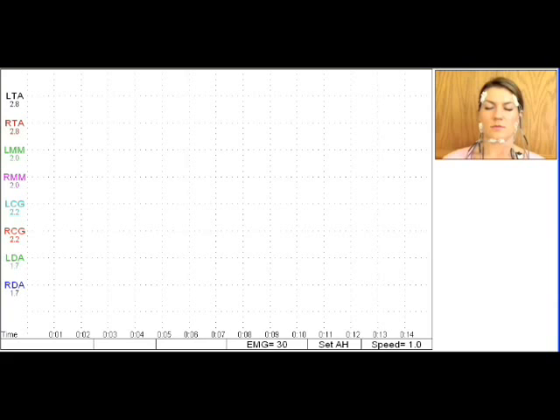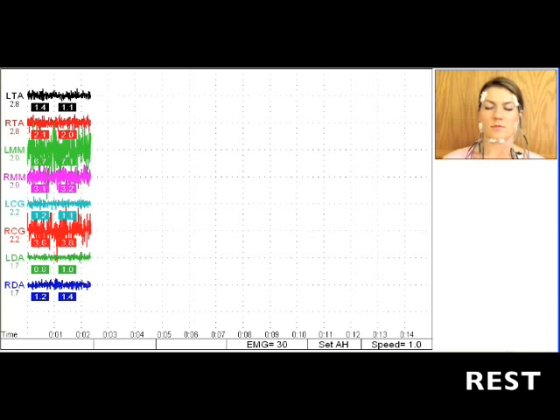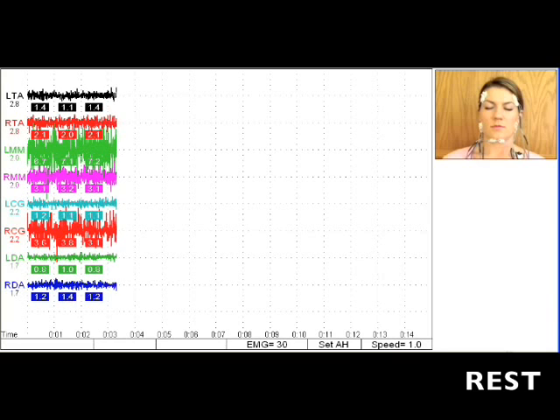Press the space bar to start recording data, and the tracings will sweep across the screen at one second per division.